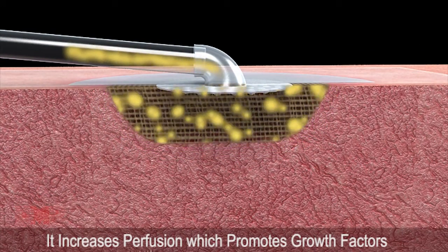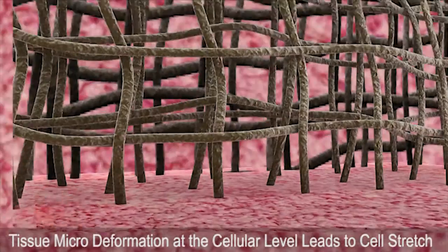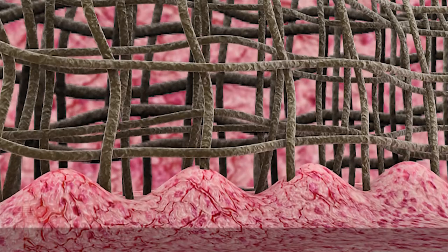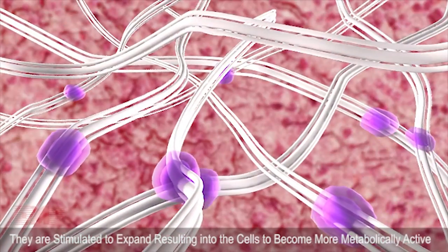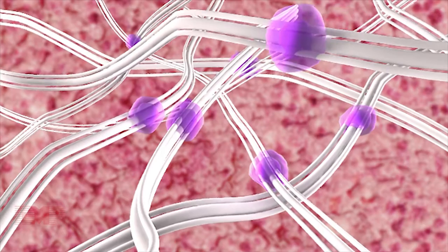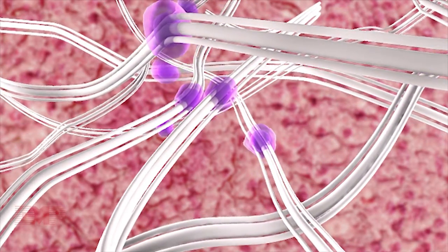The effect of the biological response is seen clearly on the wound. Tissue micro-deformation at the cellular level leads to cell stretch. Cells are stimulated to expand, resulting in cells becoming thicker and more metabolically active. This response to cell stretching has been well documented — for example, when tissue expanders are applied to stimulate formation of new skin.